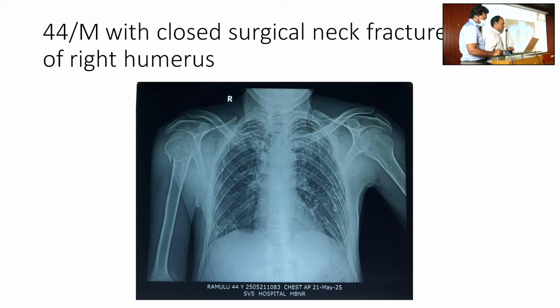Medial side, fresh fracture. Surgical neck. Are the ribs fractured? The contralateral medial end, almost near the sternum, must have gone already. With a very heavy impact, it is likely to be associated with rib injury. Rib fractures, no hemopneumothorax. No, sir.